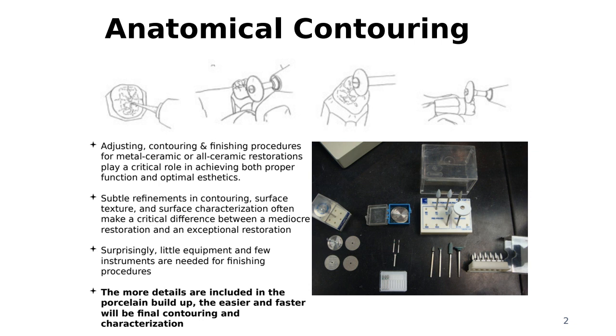So we would pick and choose. And the good thing was those samples that they had, I could try. So if it was something new that I never tried before, I could take one of his sample burrs and try it on my material, see if I like it, or how I can work with it. But usually technicians are kind of set. They find something that they like and work very well with.